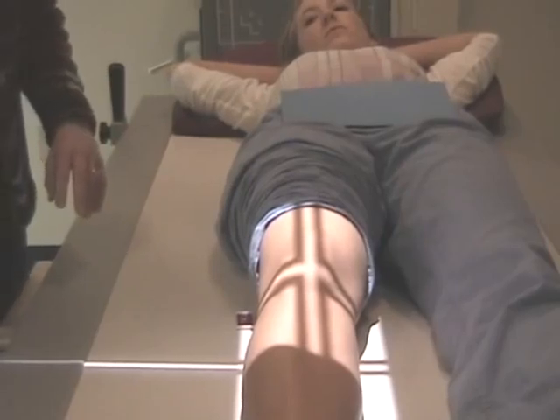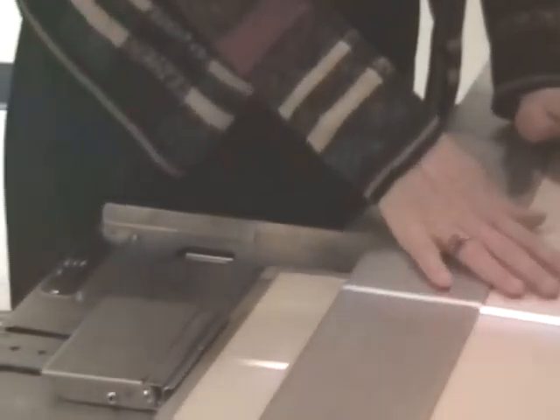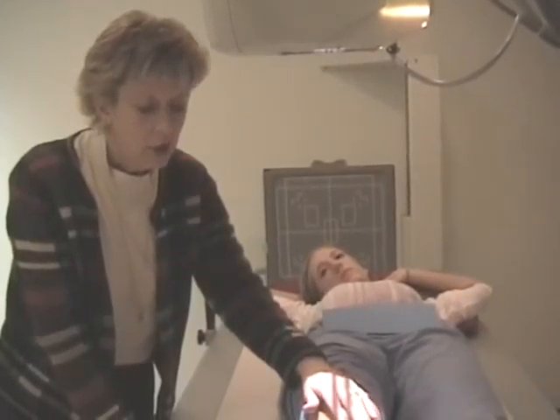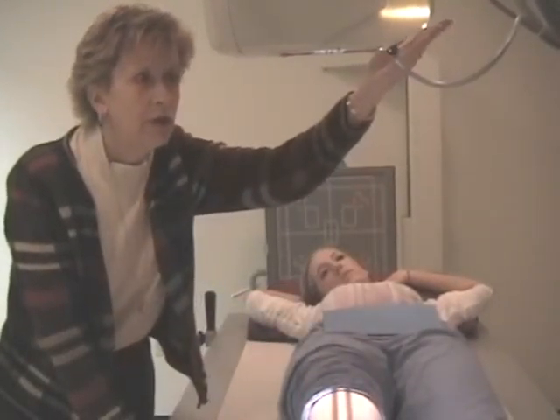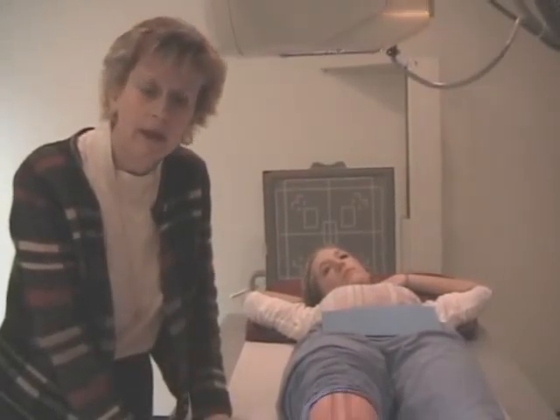So I'm a little bit more than 1/2 inch below, and then you make sure that you're exiting right back to the center of your film. And if you were angling caudal, instead of being 1/2 inch below, remember you're shooting that way. So instead of being 1/2 inch below, you might be, say, 1/4 inch below. You have to critically think that through. If you do put a tube angle on there, remember you should actually adjust your SID 1 inch for every 5 degrees of tube angle.